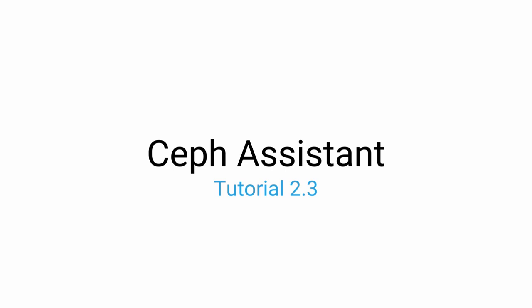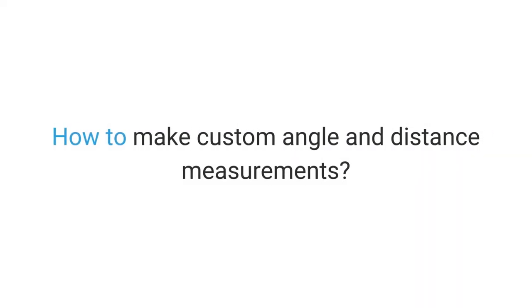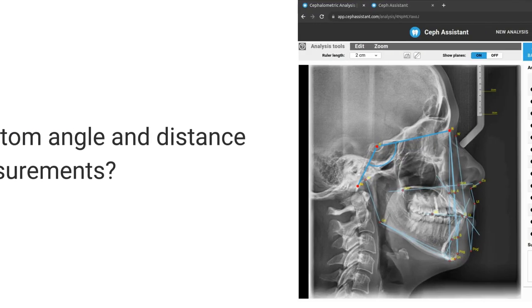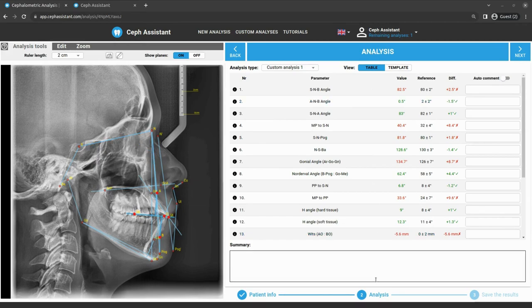Hello everyone, in this tutorial I'm going to show you how to make custom angle and distance measurements to measure anything manually. We are now in the second step of the analysis process.